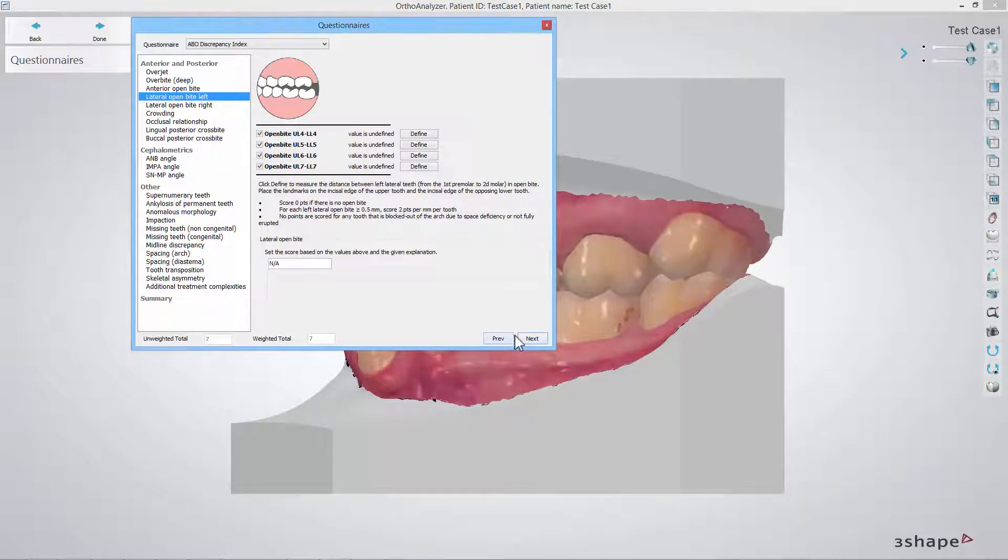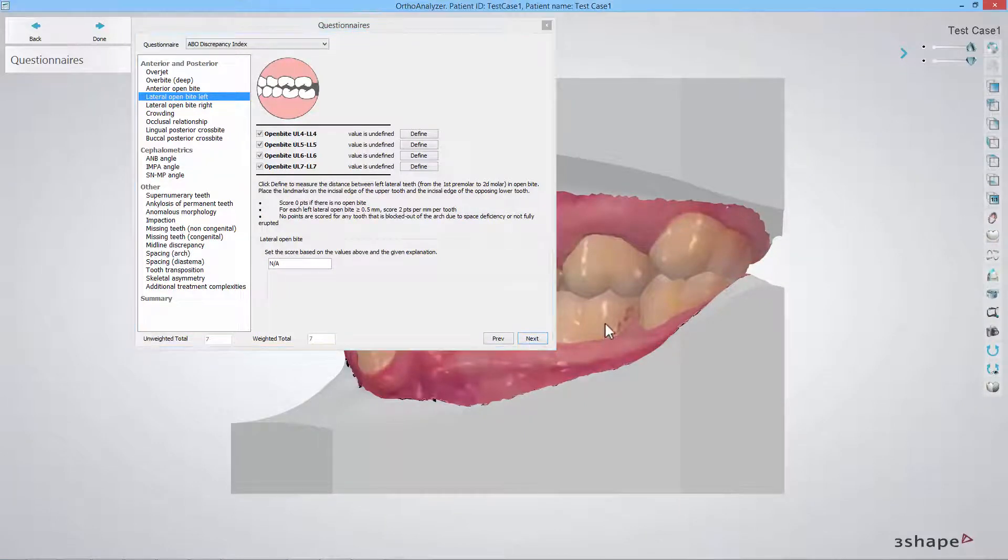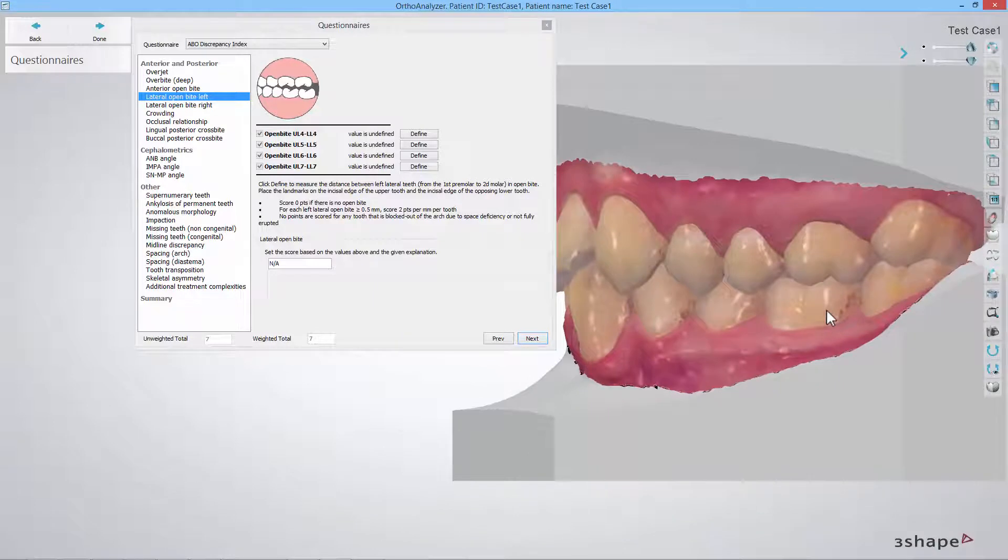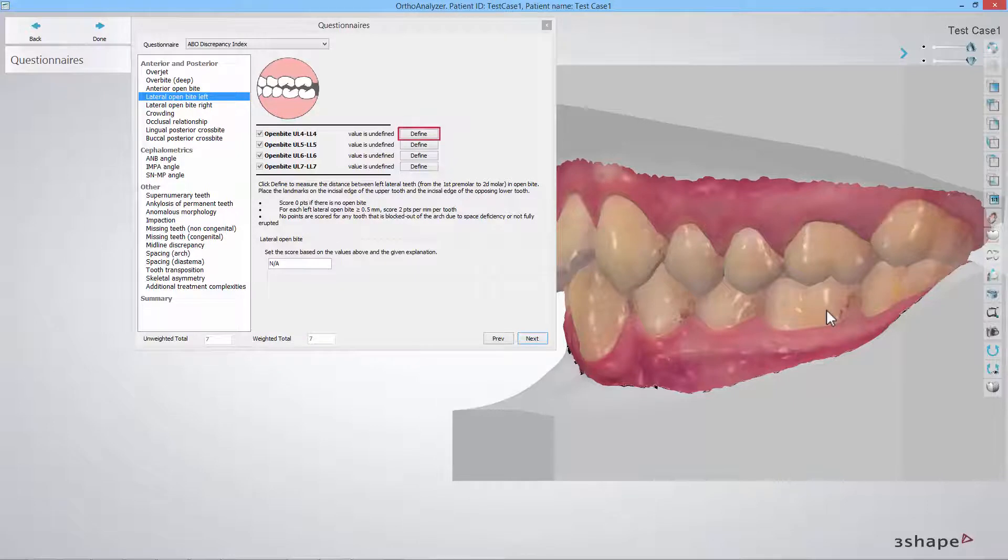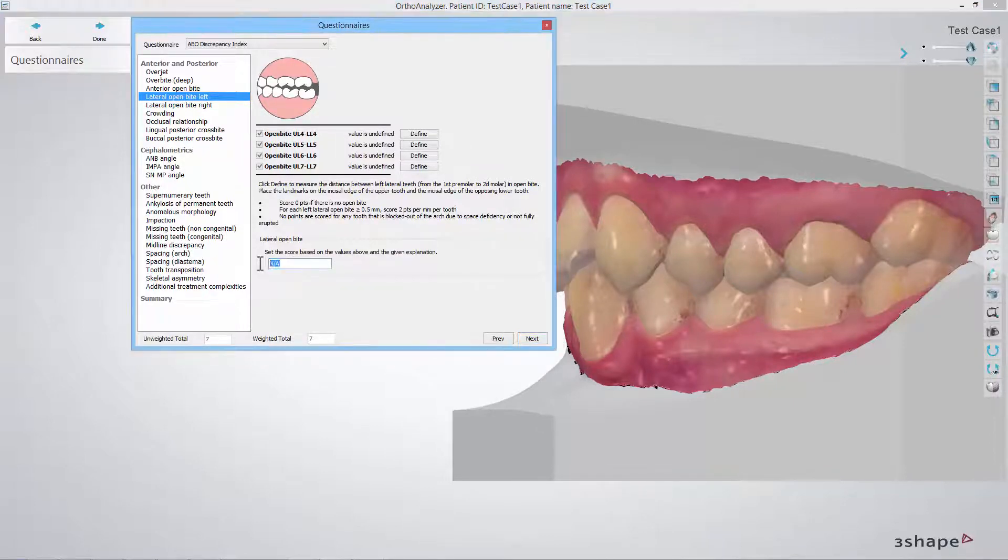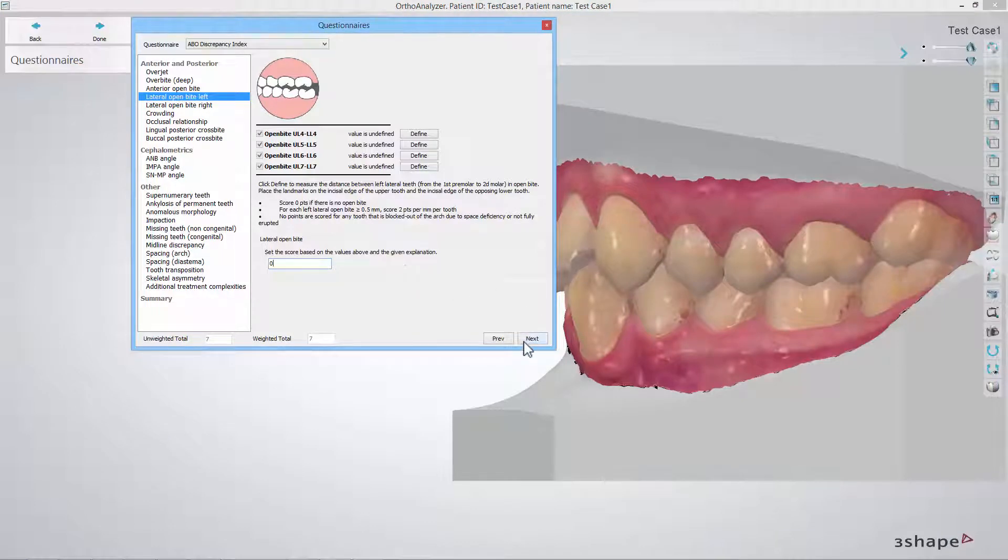In the lateral open bite left step you should inspect the model from the first premolar to the second molar. In case there is an open bite, click the define button and place a point on the incisal edge of the upper and the incisal edge of the corresponding lower tooth. Fill in the score calculated as the sum of open bite scores given in millimeters, multiplied by a factor of two.